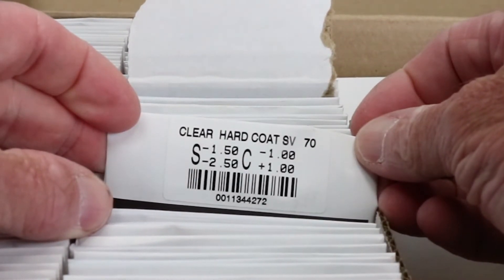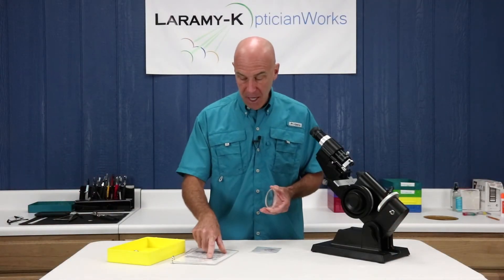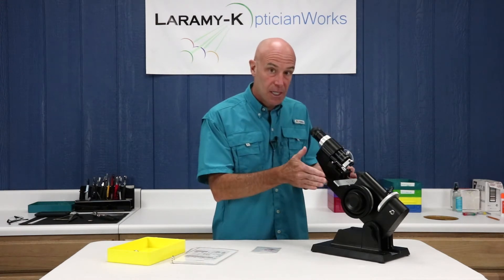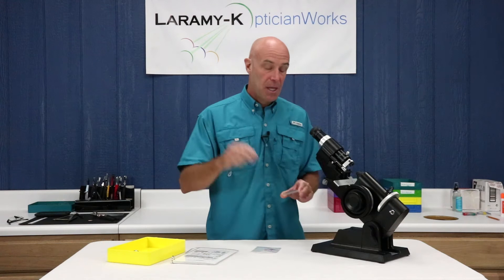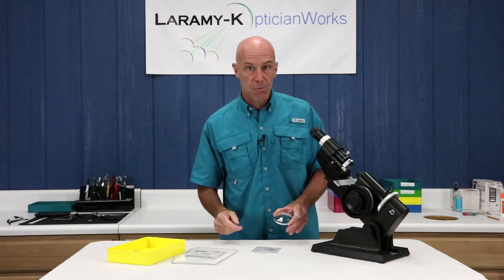There's not going to be a 48 on the outside of that package. I'm going to rotate that minus 150 to be at 48 degrees in the lens meter, spot it up, then I can put a block on it, then I can edge it, then it can be mounted in the frame, and everything will stay consistent through the process.